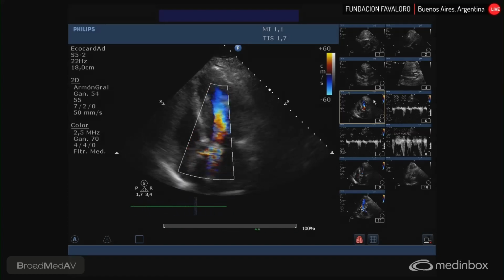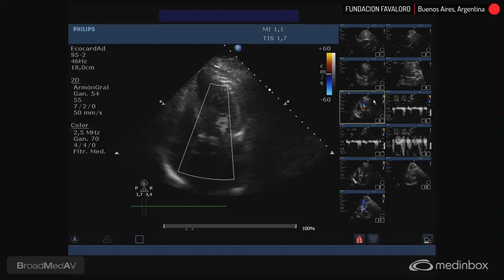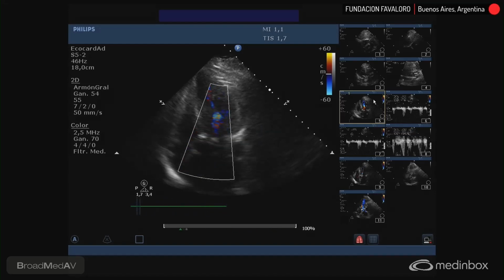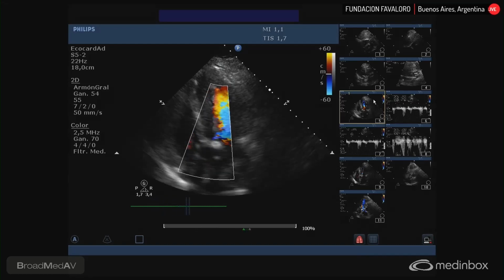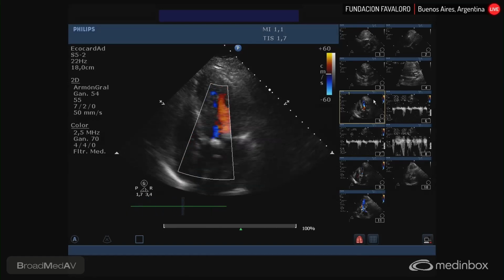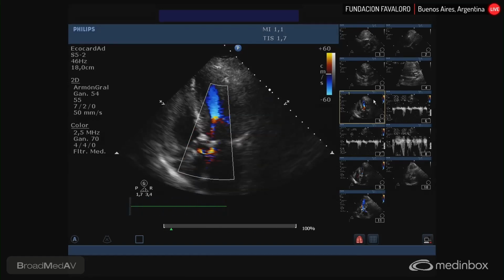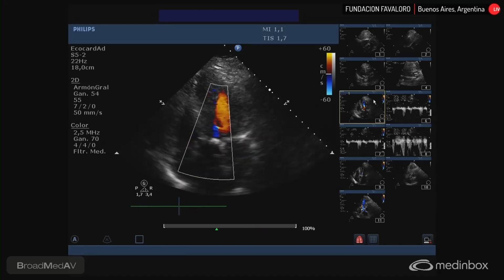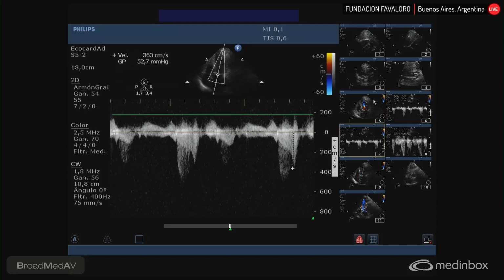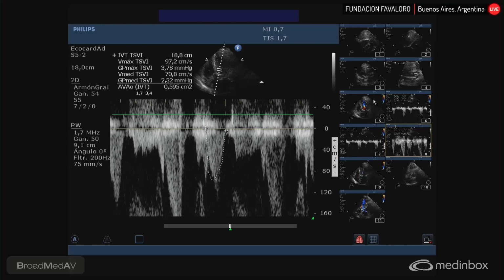Well, as was mentioned before, the patient has a preserved left ventricular ejection fraction with an important concentric hypertrophy. As you can see in this loop, that severe hypertrophy causes, as you can see in the color Doppler, an intraventricular gradient that was measured at 52. What you can also see is an important calcification of the aortic valve that causes a severe aortic stenosis with a peak velocity of 4.5 and a mean gradient of 52. That gives an estimated aortic valve area of 0.6 square centimeters. So it's a really severe aortic stenosis.